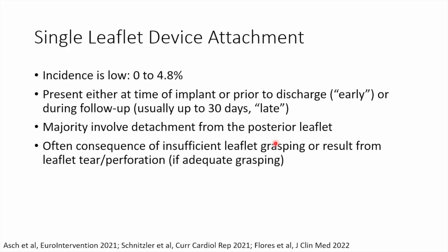It's more rare later on because you have that fibrous encapsulation of the tissue bridge, so they tend to stabilize the leaflet more, and so SLDA is less likely in those times. The majority of the time, they actually involve detachment from the posterior leaflet. I think there's probably multiple reasons for that.